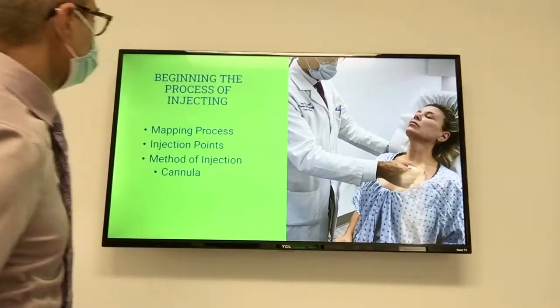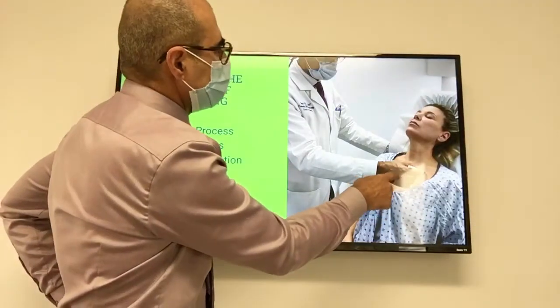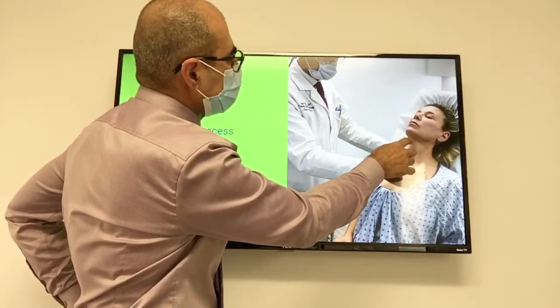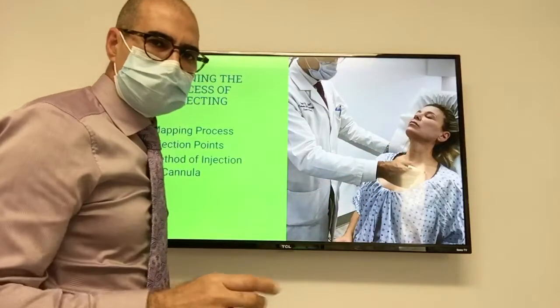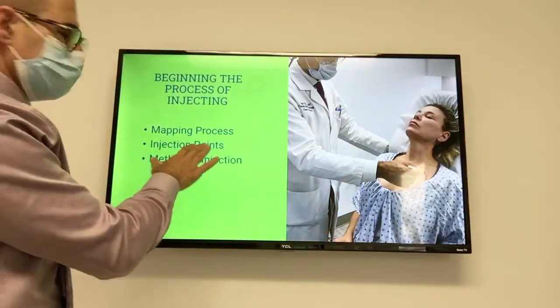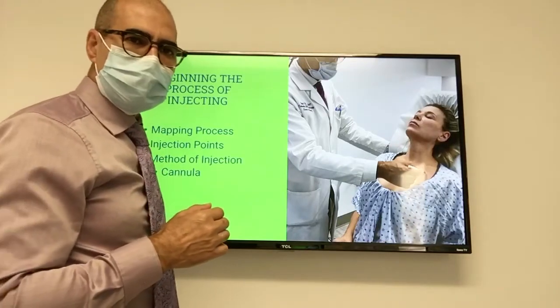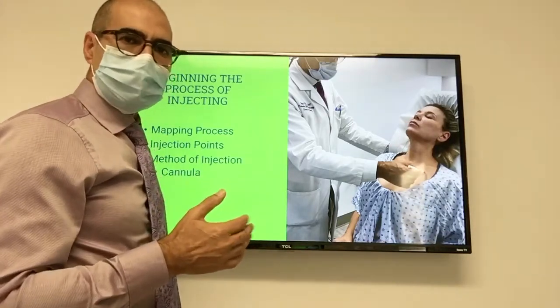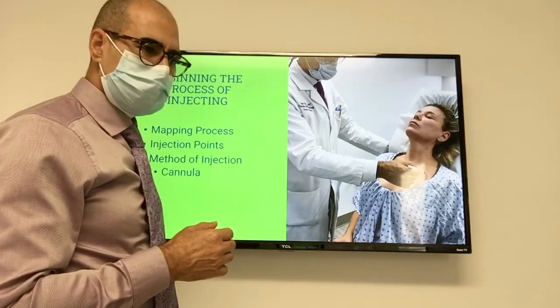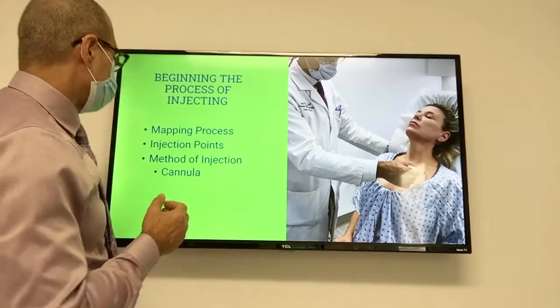This is a patient who had fine lines on her chest, but also laxity of her neck. You cannot really see that, but we'll definitely show the before and after. The way it works is, we map the process first of all. Anything that I do, I am always very careful not to start a procedure unless I have the whole plan in mind. Otherwise, I think it's messing with a procedure that may not produce the results.